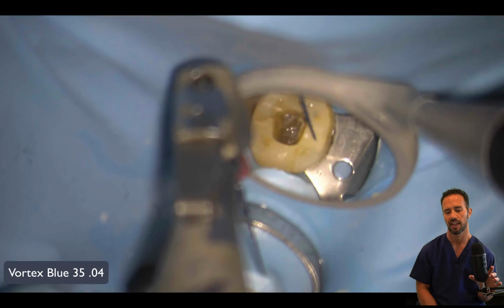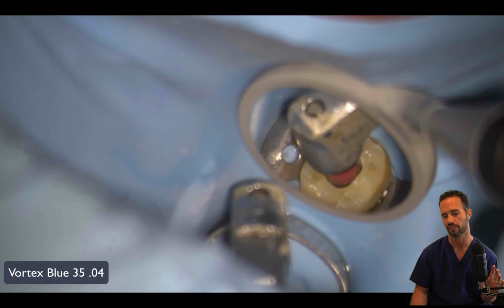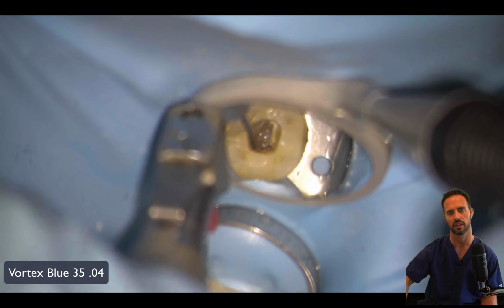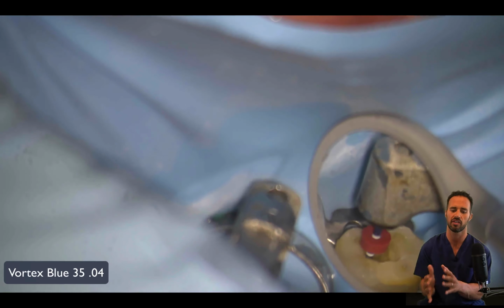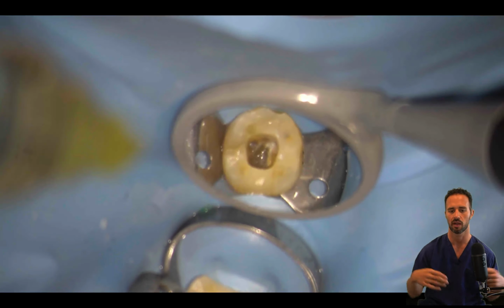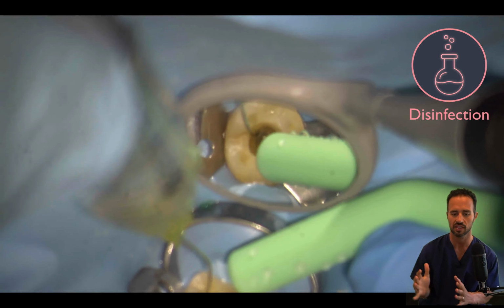Good. And then our DB, again, 20.5 millimeters. And this file should slip and slide all the way down to the apex without any resistance. Because remember, this already has been prepared to the same exact file. We're just basically removing any calcium hydroxide that's in there so that we can obturate the case. And now we're going to go ahead and move forward with our disinfection stage already.